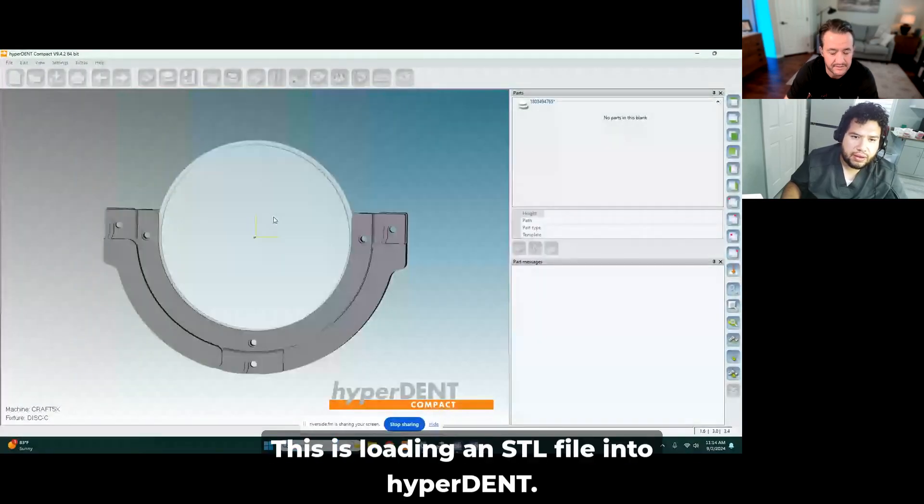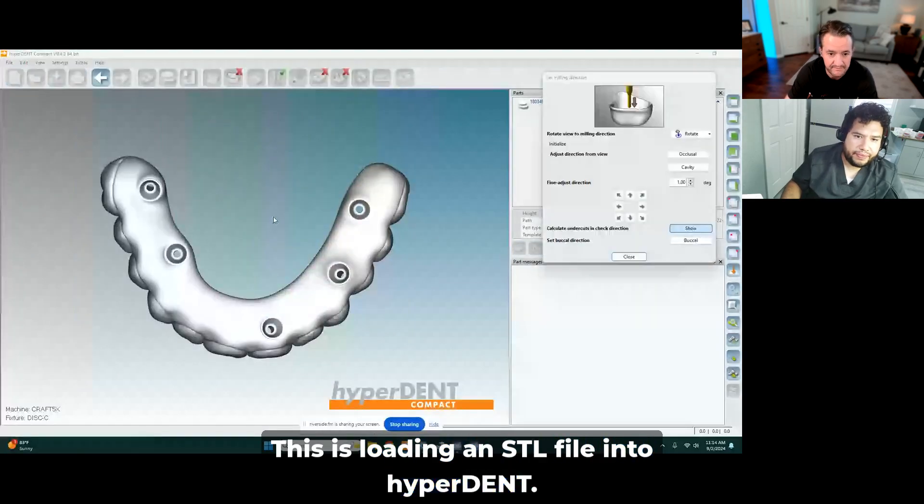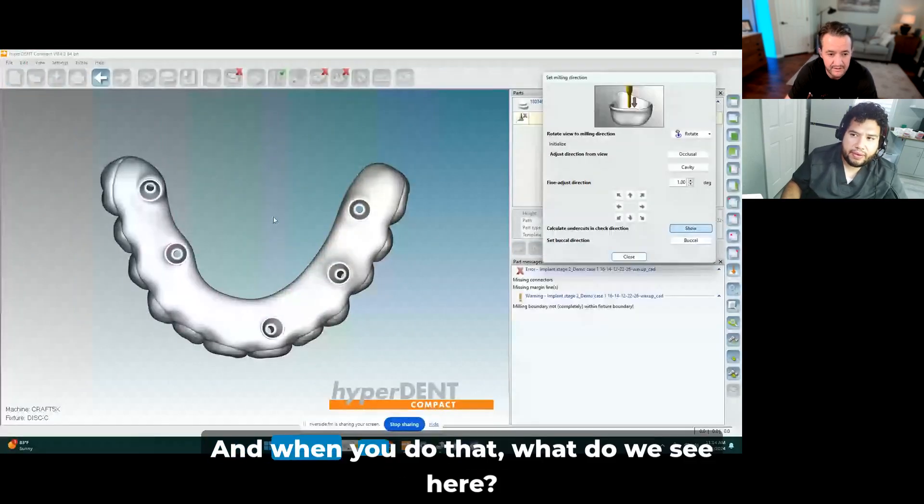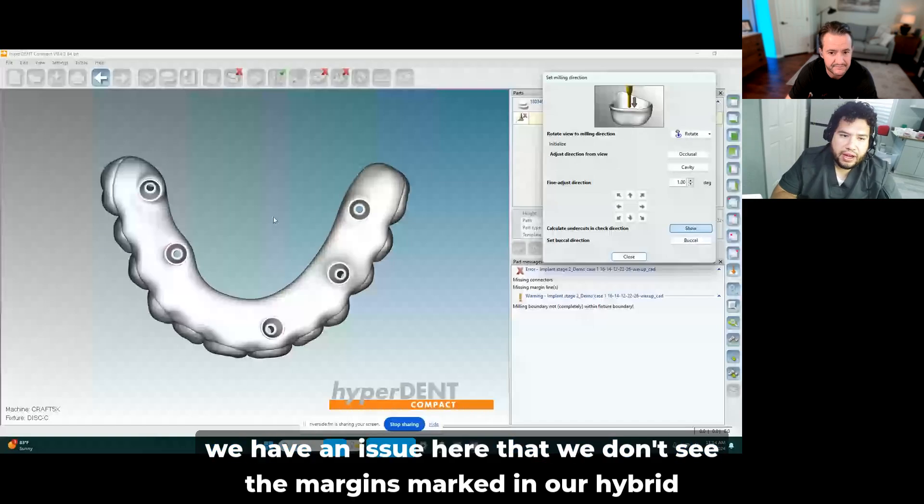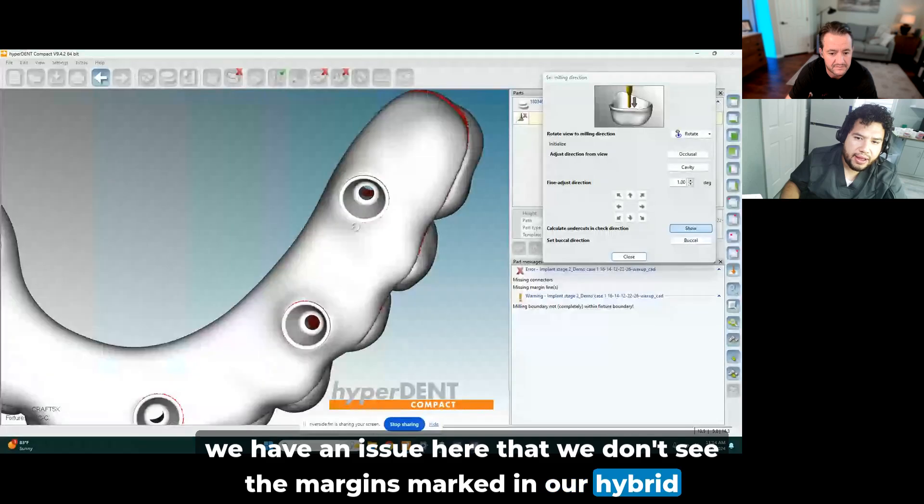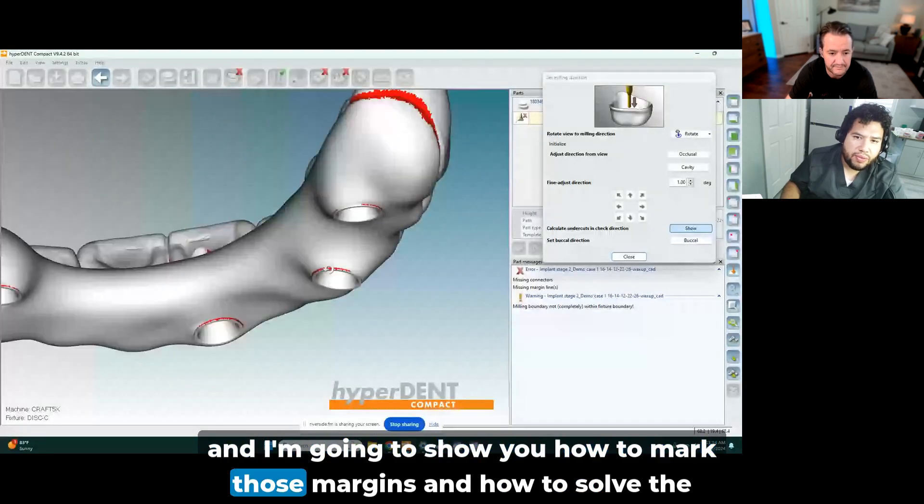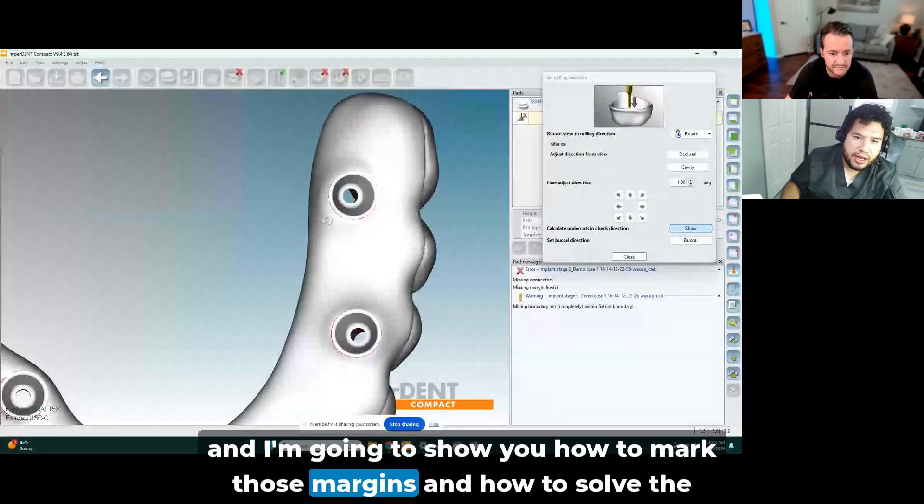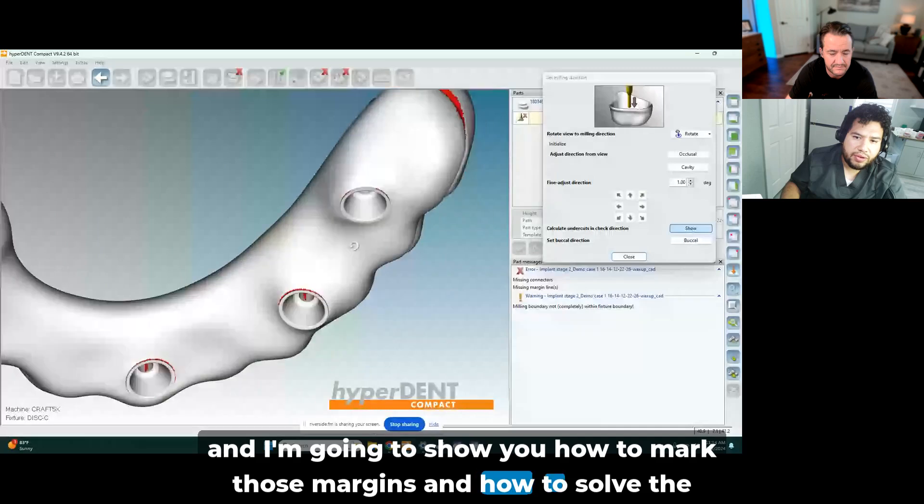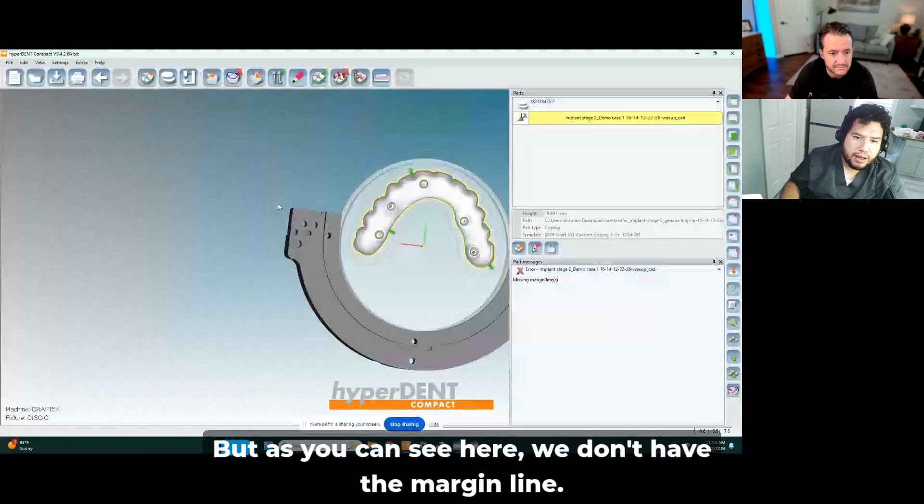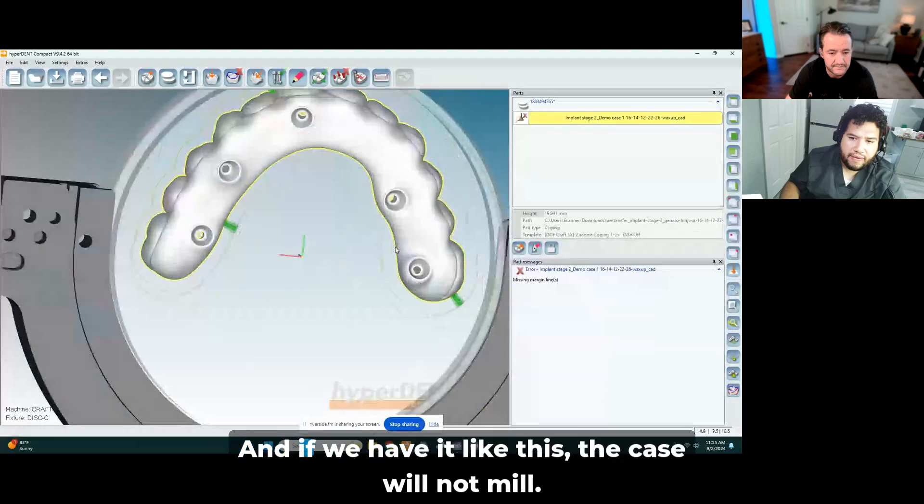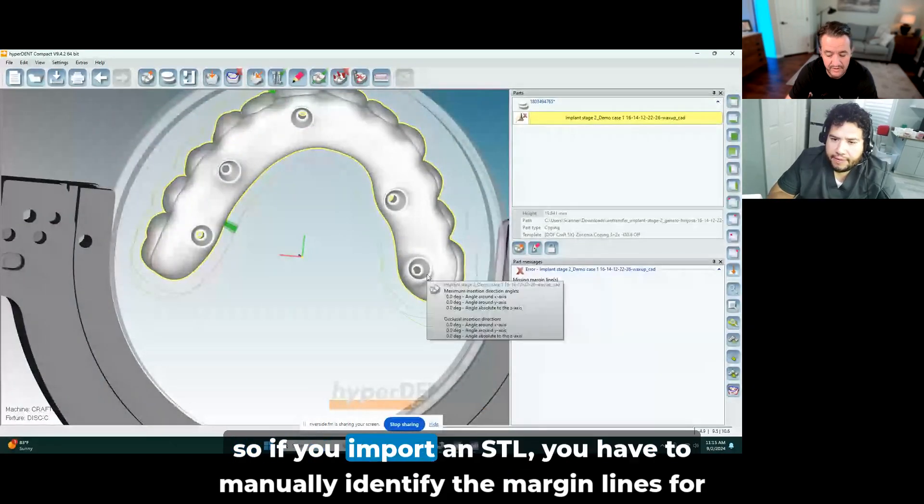So this is loading an STL file into HyperDent. When you do that, what do we see here? We have an issue here that we don't see the margins marked in our hybrid. I'm going to show you how to mark those margins and how to solve the problem here. As you can see, we don't have the margin line, and if we have it like this, the case will not mill.